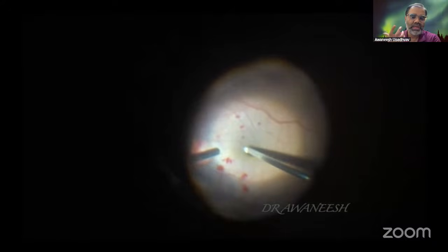I'm peeling and then removing the remaining ILM till the arcade, and then I use viscoelastic. Viscoelastic can be used using a soft tip, and in the first case, I used a 26 gauge long needle which was cut at the edge. With that also, you can slowly inject the viscoelastic over the fovea. I do tend to decrease the intraocular pressure and bring the IOP to 25, so that the pressure doesn't go up. You can maneuver using the ILM forceps or the cutter so that the scaffold is nicely placed, and then you can stabilize this with a PFCL.